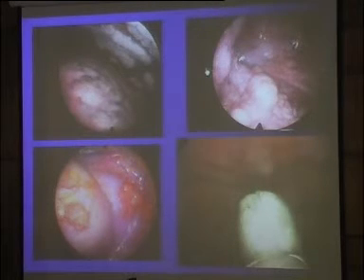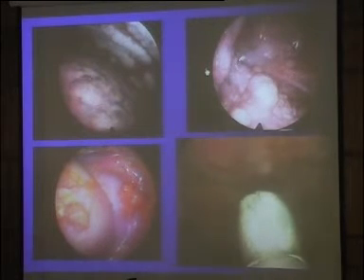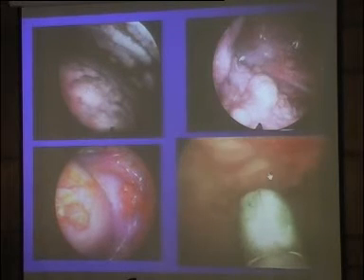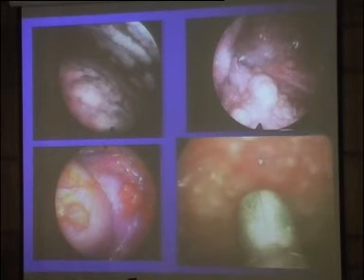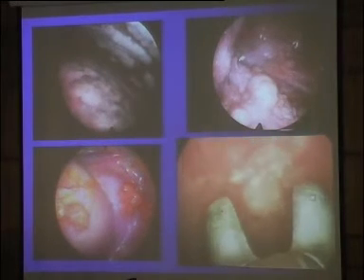No, I mean to see. But it's a bayonet. And it's like this. You see like this, and you have the channel just under. Again, it's optical biopsy. You do like this under visual control. You understand? Do we use the fiber optic or what? No, this is optical biopsy forceps.